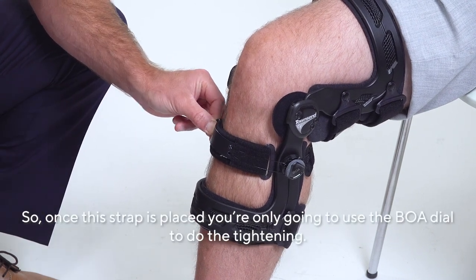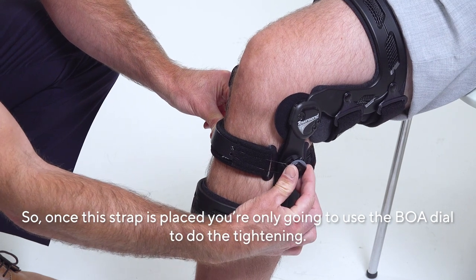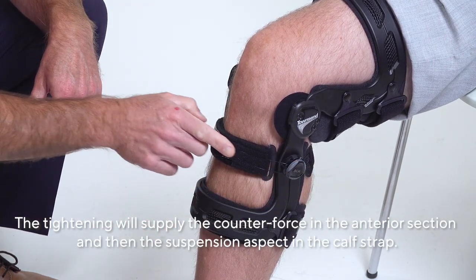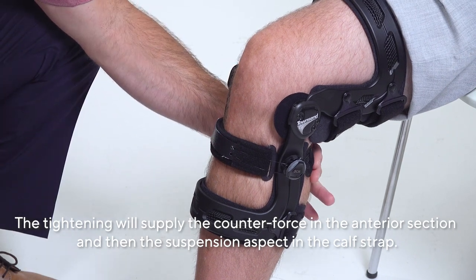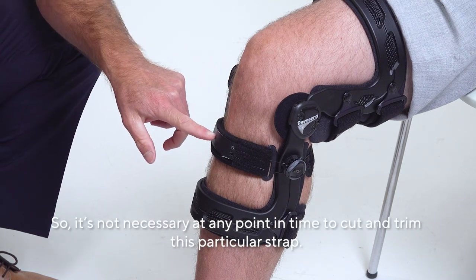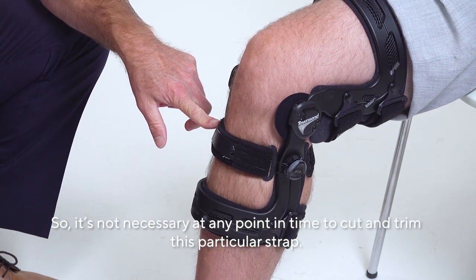Once this strap is placed, you're only going to use the BOA dial to do the tightening. The tightening will supply the counterforce in the anterior section and the suspension aspect in the calf strap. It's not necessary at any point to cut and trim this particular strap.